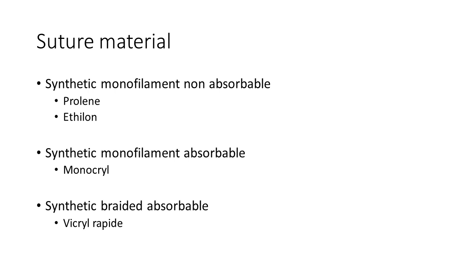Finally, there is the synthetic braided absorbable suture, Vicryl, which again is broken down by the body and stays in about 10 days. Vicryl Rapide, the synthetic braided absorbable suture used on the skin, is an undyed material, unlike Vicryl, which is purple and can tattoo the skin. This dissolves after about 7 to 10 days.